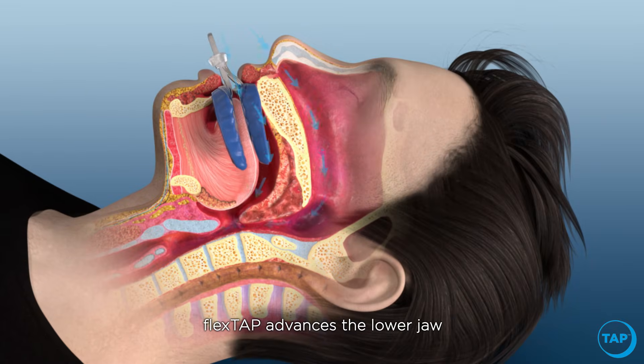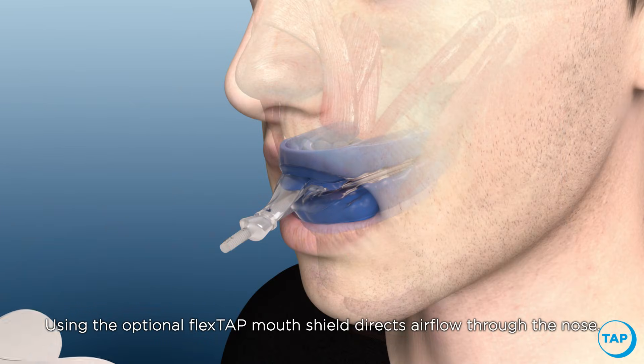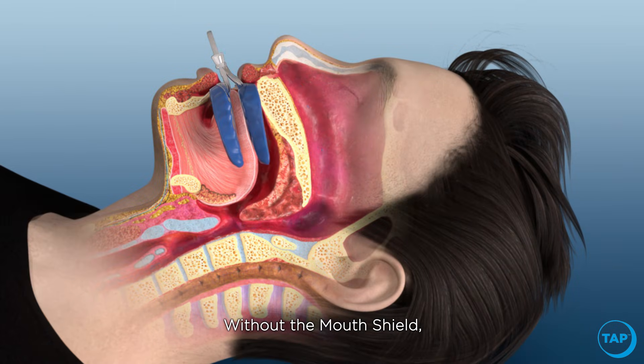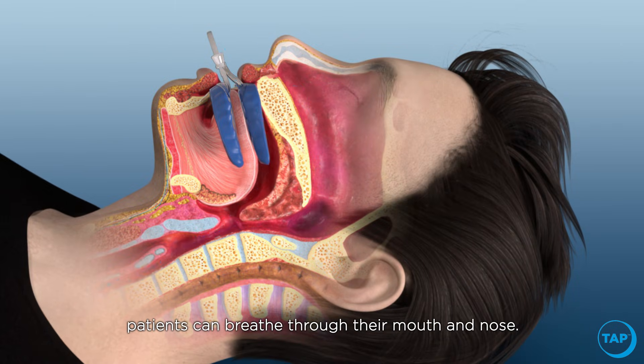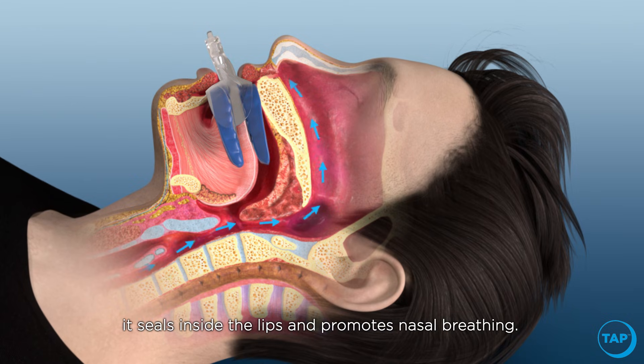Flex Tap advances the lower jaw into a comfortable position that opens the airway and prevents sleep apnea. Using the optional Flex Tap mouth shield directs airflow through the nose. Without the mouth shield, patients can breathe through their mouth and nose. By sliding the mouth shield over the post, it seals inside the lips and promotes nasal breathing.